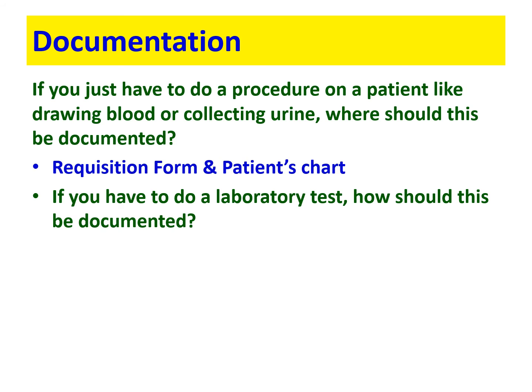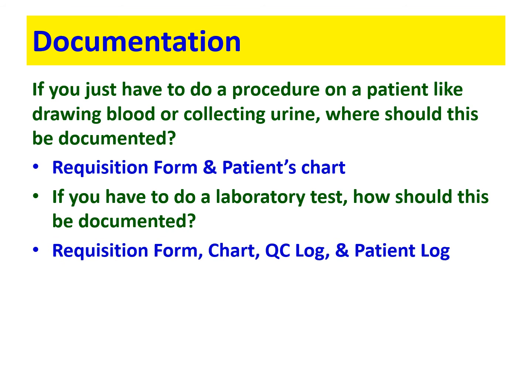There are some additional steps with that, right? You still need to fill out the requisition form. It still needs to be charted, but you would also need to check the QC log to make sure that QC had already been run on whatever test your doctor ordered, or you need to run QC on whatever test your doctor ordered before you do the test on your patient. And then you must log on your patient log every patient that you do a laboratory test on.